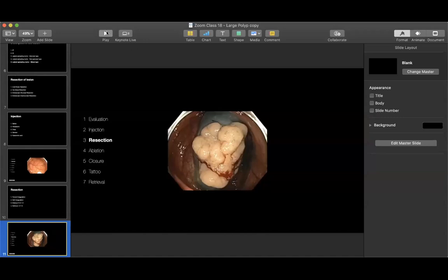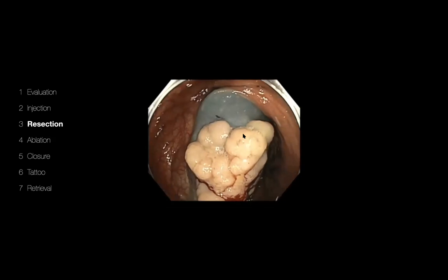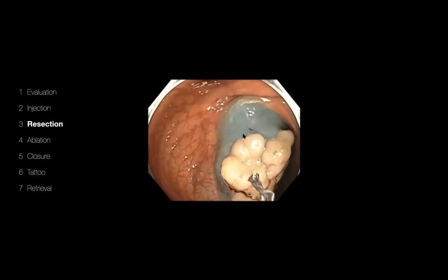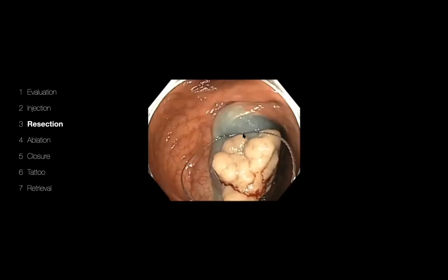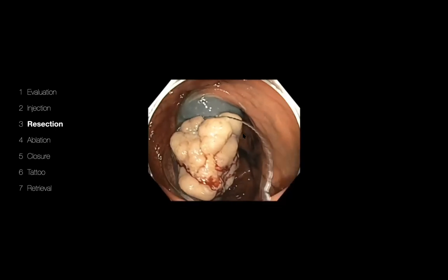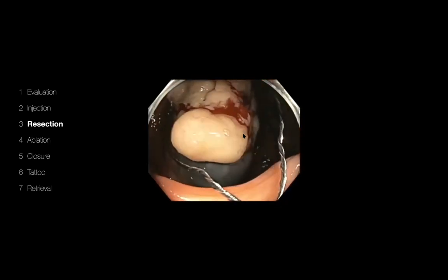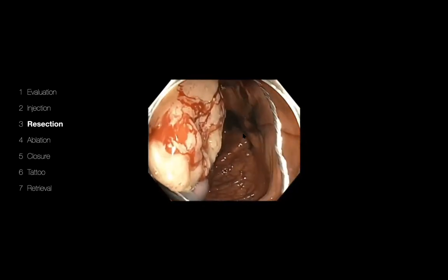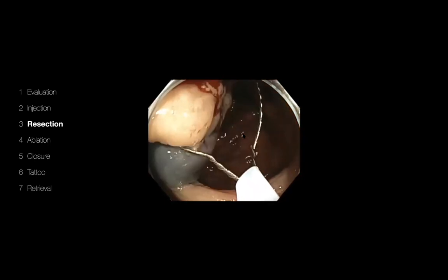So it is important that when you close the snare, you're really pulling it away from the muscle layer. I couldn't discern whether he had done this step, whereby the assistant opens the snare slightly, the tip of the snare is lifted up slightly, and then it closes.